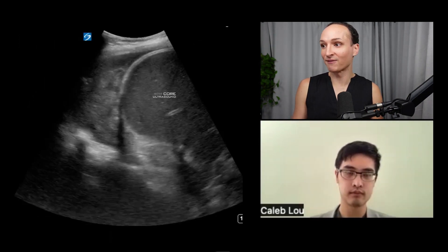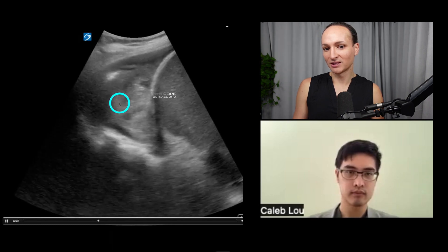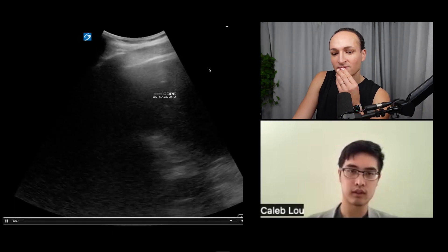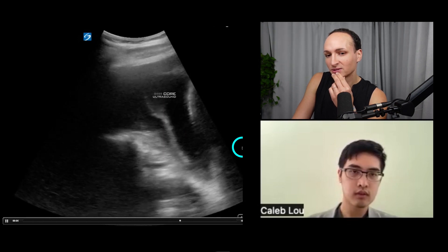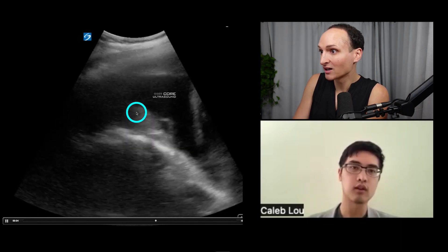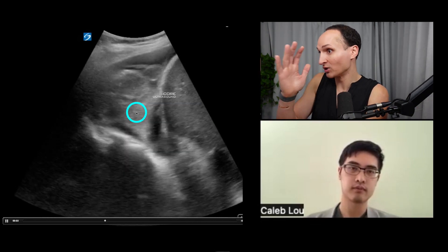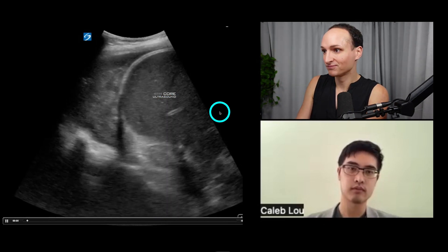This patient came in after an MVC. This is liver, this is the diaphragm. What are we seeing up here — that jiggly boy? It is a pleural effusion. But why is it so jiggly? The lung usually has a nice border and doesn't jiggle so much. This is actually what clot looks like — you can see it move a bit with the diaphragm.